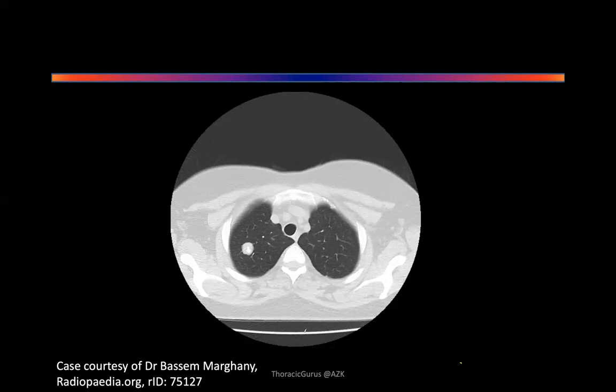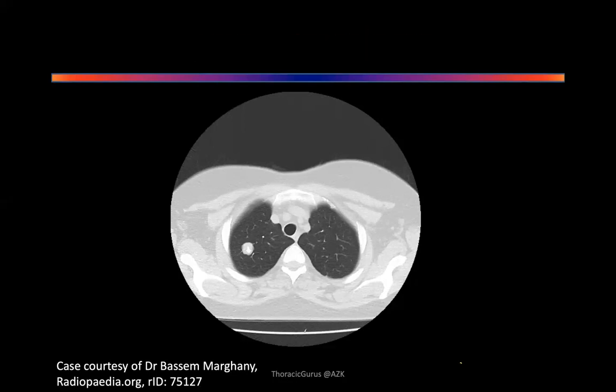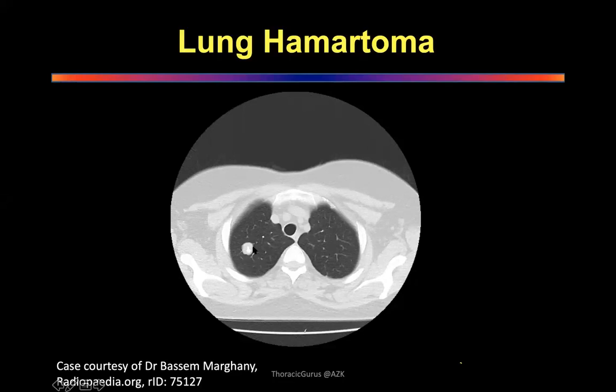Sir, if I can see the similar lesion in prior X-rays, it has calcification for more than 2 years. Excellent. And it's less than that is the answer. Well done. Excellent. You want to see the prior calcification in that, okay? And you want to know whether this has changed or not changed.